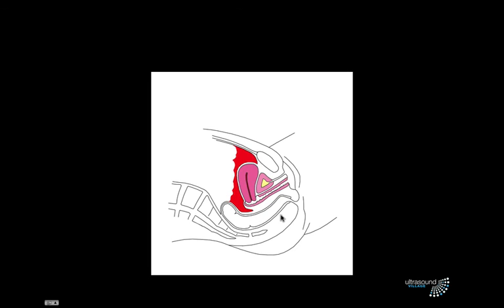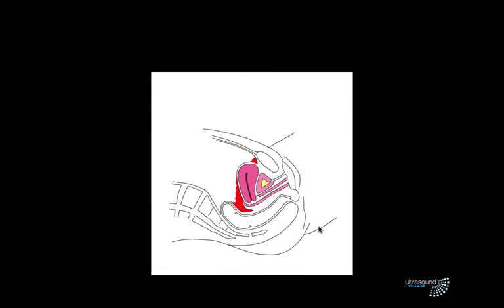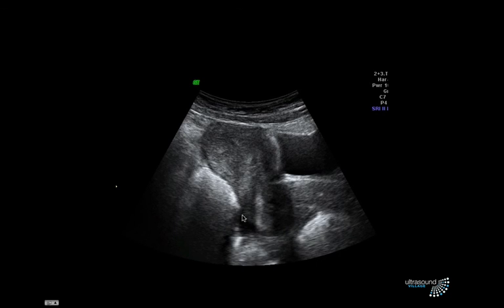As you get yet more fluid, it does this, and you'll have this big black area around here, the uterus inside it, and sometimes the blood comes right down in front here as you get more and more, and the uterus floats free back here, and you have blood all around the uterus. Here's a small amount of free fluid just behind the uterus in that longitudinal view. So there we go, that's that equivalent there. Here's another one, a little bit of free fluid in the pouch of Douglas. Important not to confuse the bladder with free fluid.